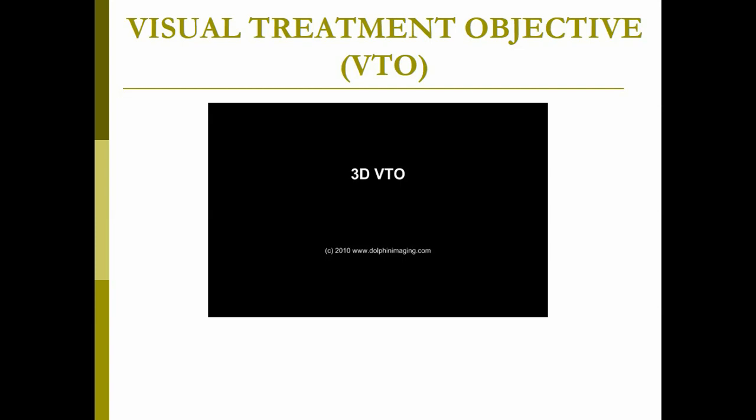That means whether it is the mandible at fault, whether it is the maxilla at fault, and then we treat accordingly. Now, this one is an advanced 3D VTO where you can actually use a software and check what is at fault in the patient and what has to be done. So if it's a growing patient, you plan a myofunctional appliance, or for that matter an orthopedic appliance for its correction. And if it is a non-growing patient, then you plan an appropriate surgery. So this 3D VTO will help you find out what is the etiology of the patient's skeletal problem. So I'll show you a small video.